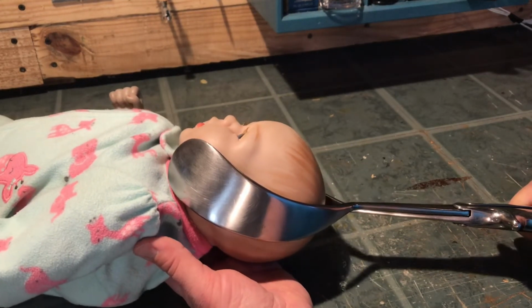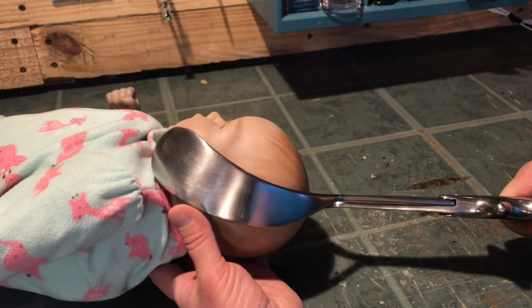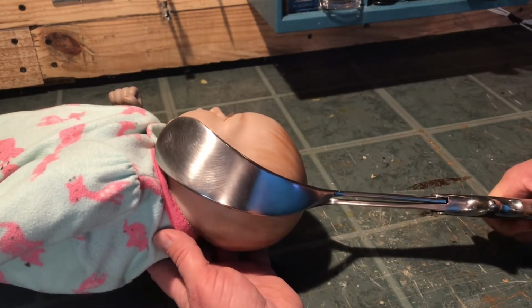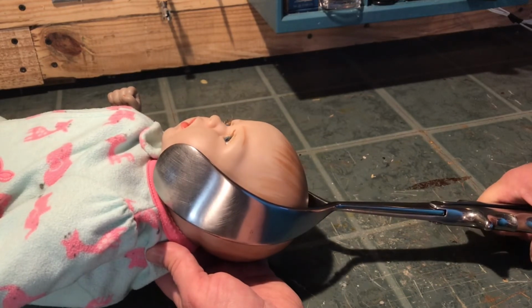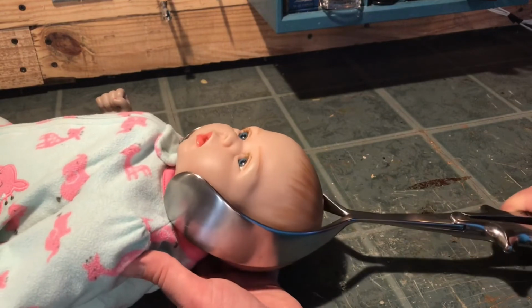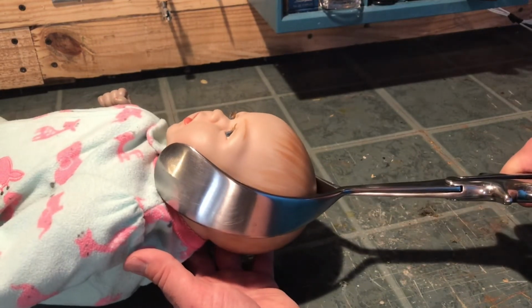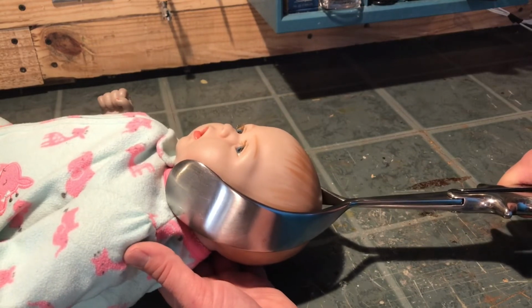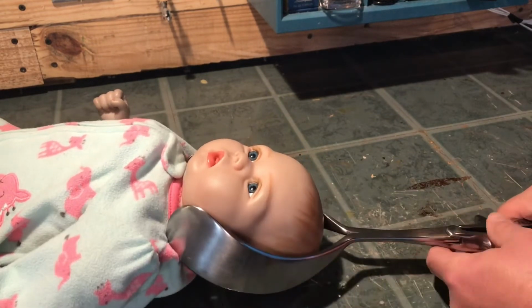And again, I'm in no way a professional with this, just want to throw that disclaimer out there again. Just reading up on the internet in different articles. So one of the things they talk about is not rotating baby using the delivery forceps, just using forearm strength and gently pulling down with contractions to assist in the delivery.